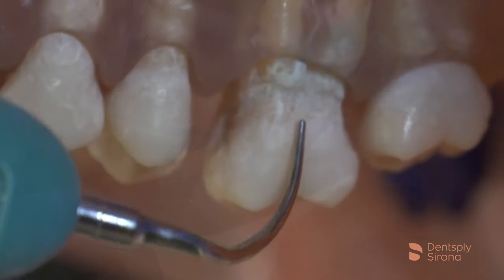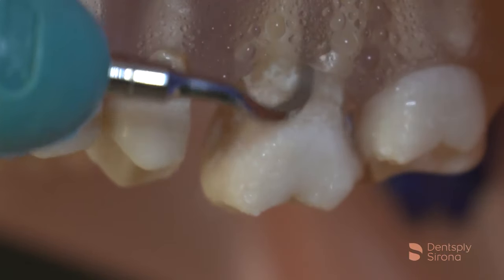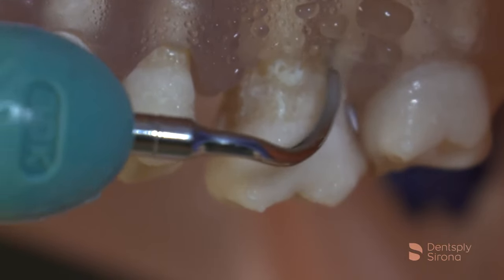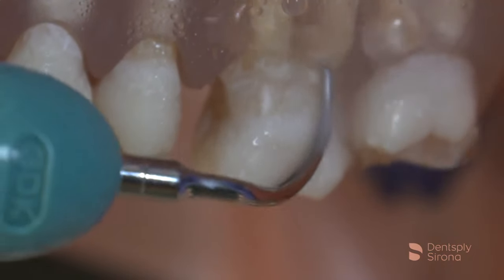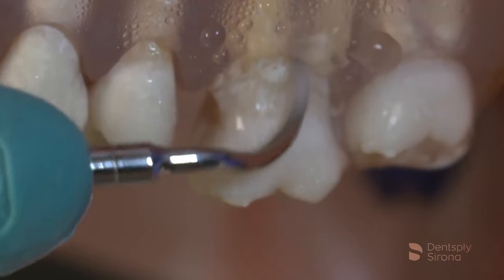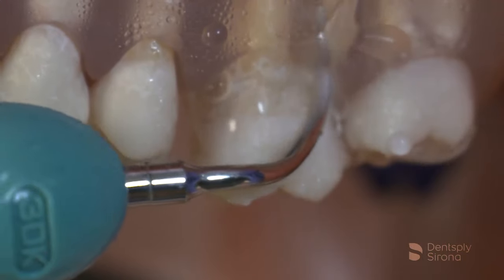Begin on the clinical crown, float subgingivally, riding the anatomy and clinging to the pellicle while always maintaining 2 to 3 millimeters of adaptation and no more than 15 degrees angulation. Navigating the pocket, assess while entering and engage any deposit encountered with a gentle tap. Frequent, methodical, overlapping strokes are essential in the periodontal pocket to detoxify and debride every square millimeter.